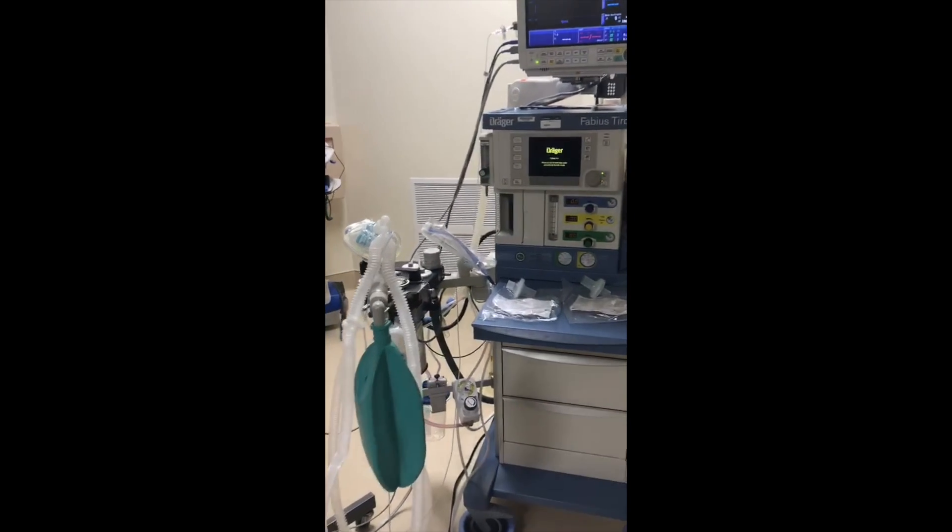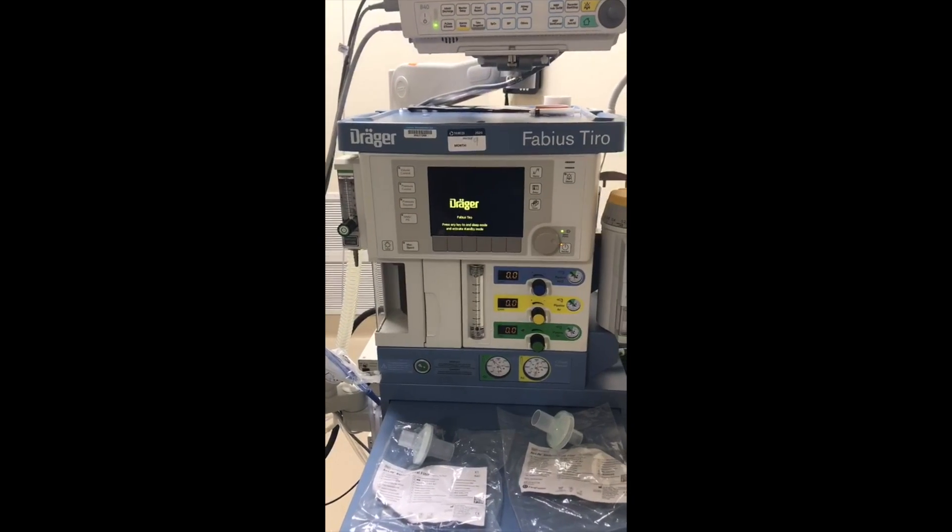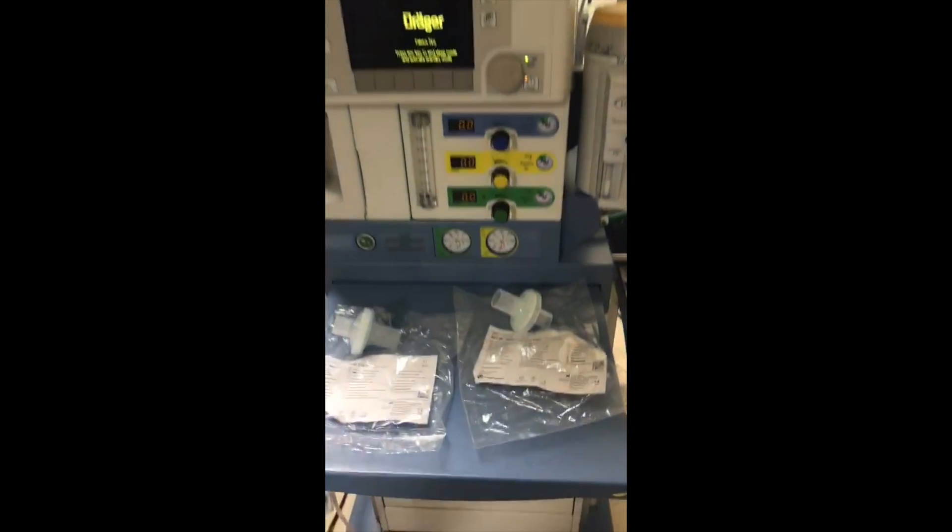Here we are — we'll do a demonstration with the Draeger Fabius Trio, the same thing we did with the GE machine: hooking the circuit up, testing with viral filters, and disconnecting the scavenging.